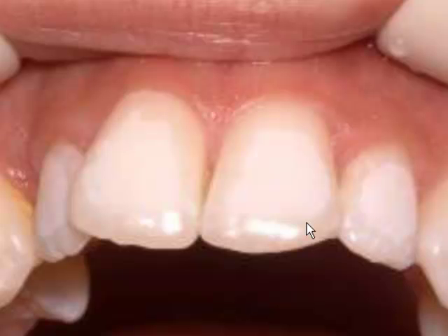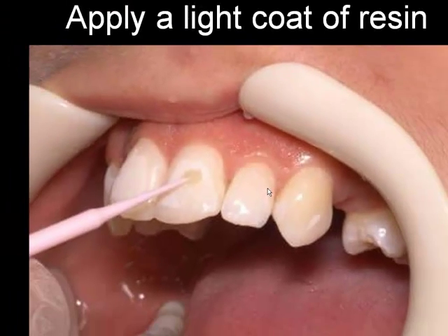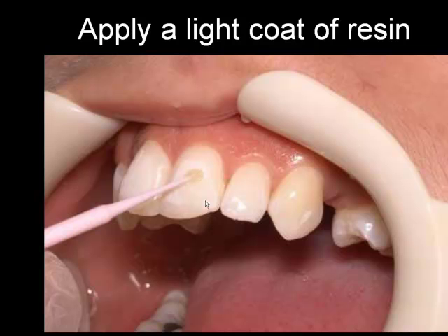If you don't see the chalky white appearance, the prophylaxis was probably not efficient. In cases of composite resins, before doing any etching, you have to roughen up the composite to ensure that the new bonding from the composite system will let the bracket bond to the old composite.